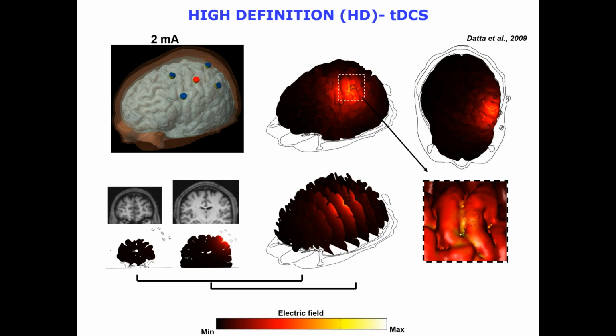So we'll see how far we can get with that, and then they go into one of the passive non-invasive neuromodulation techniques, let's say like tDCS. So we might take a couple of really significant areas that we find are disconnected in autism, and take two or more of those hubs and stimulate them at the same time.